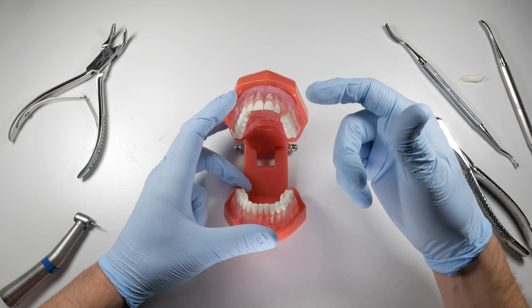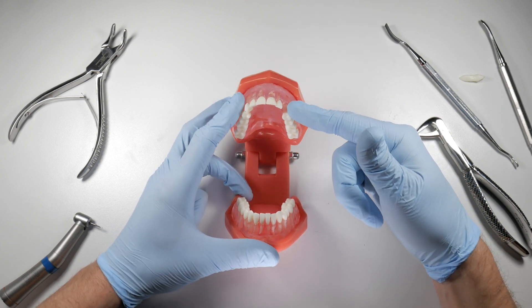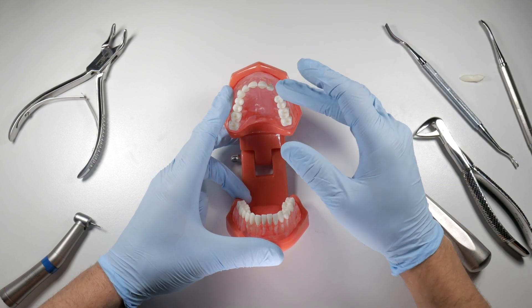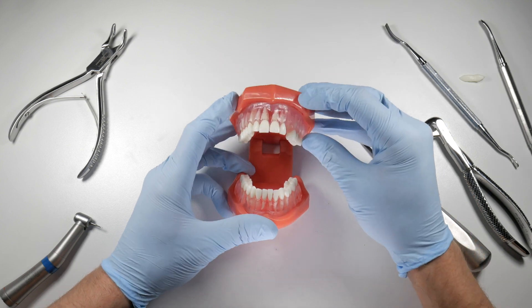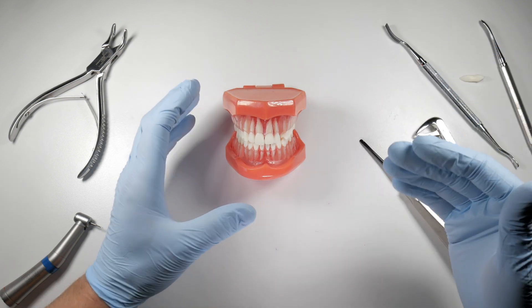Once that's done, place your suture. If this is in an aesthetic zone and the patient was planning an implant, this would be an indication to place a membrane and a bone graft to build that area up while it heals. For those without bone grafting experience, proceed as described without the graft.